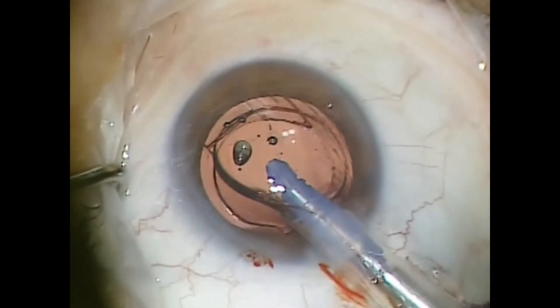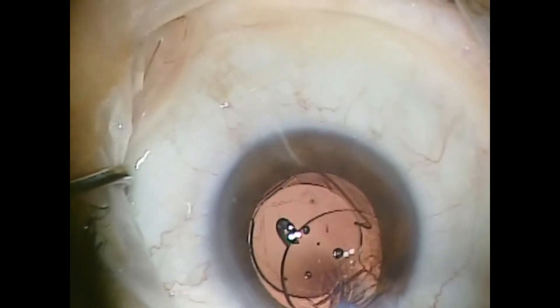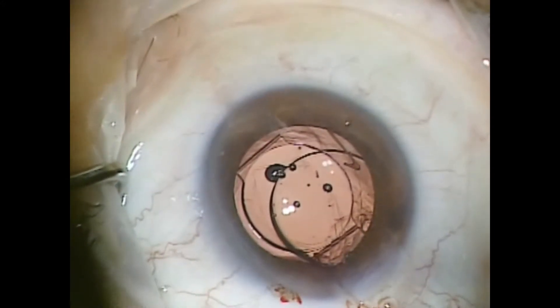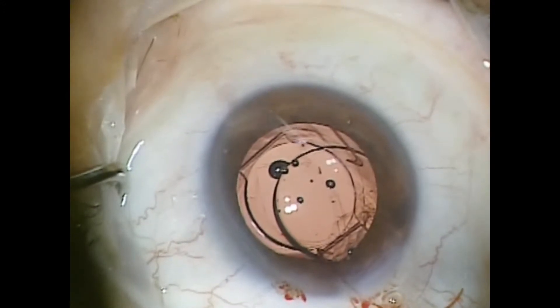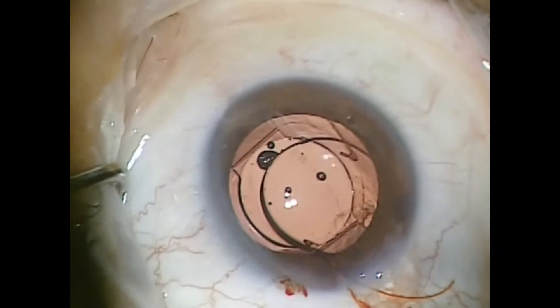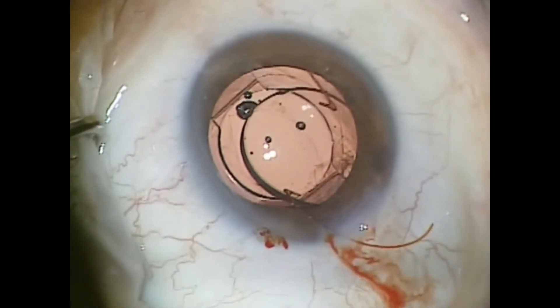These are thick lenses. You don't want them to pop in the eye and push on the lens or push vitreous out of the eye. I just go slow and gentle and leave the trailing haptic out of the eye. Then I like to grab the trailing haptic with the .12 forcep and simply drop it into the sulcus.